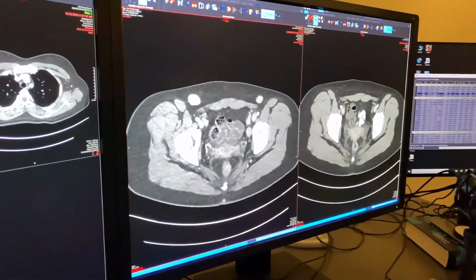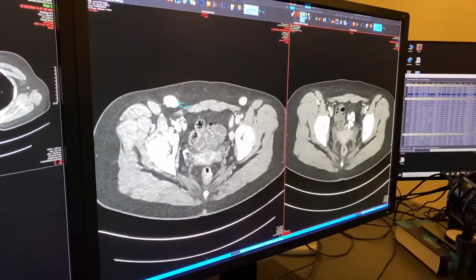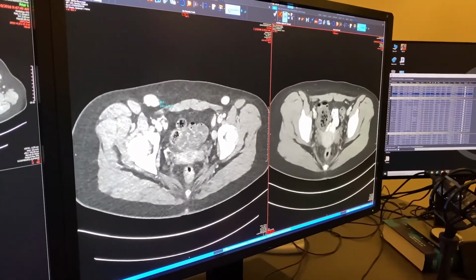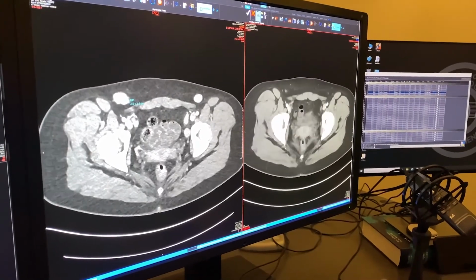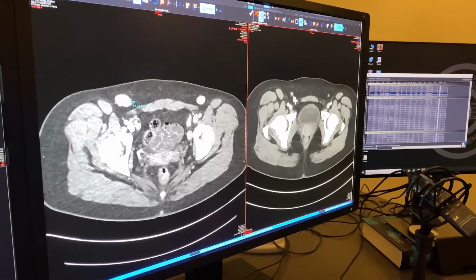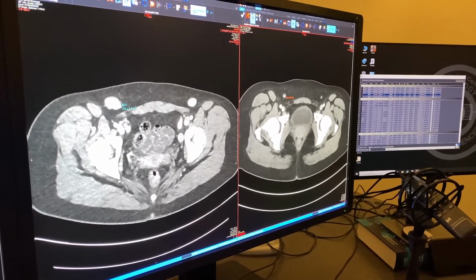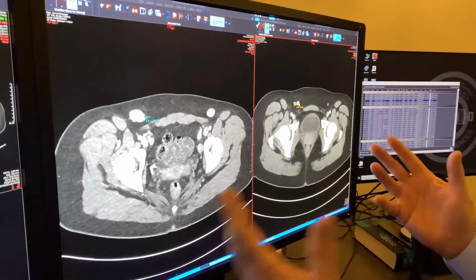So both of these are enlarged. Let's look at this one. And it's not followed up, so I break the registration, come into that one. Look at that. It's so much smaller, it's hard to find. It's like disappeared right here. So then measure it again and then see if it picks up on it, because they're registered, meaning over time they're co-registered.